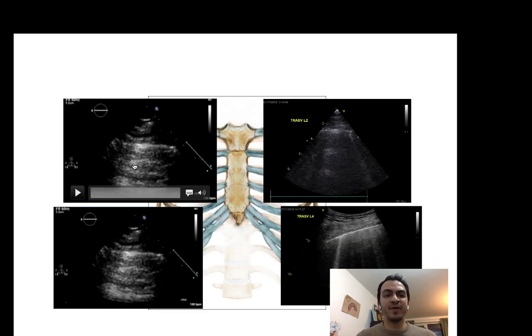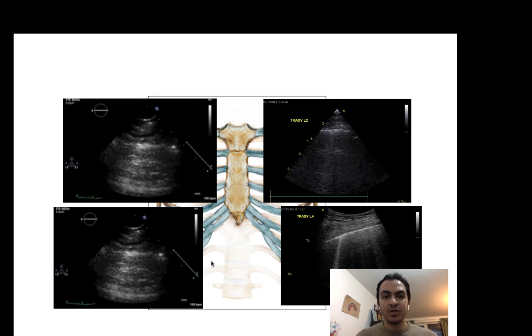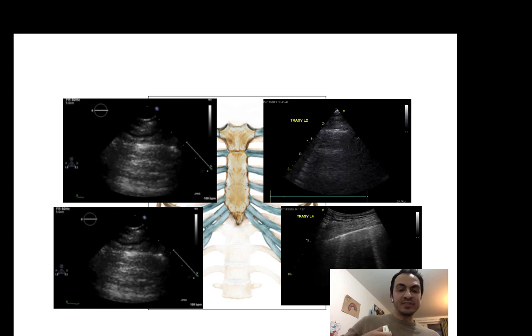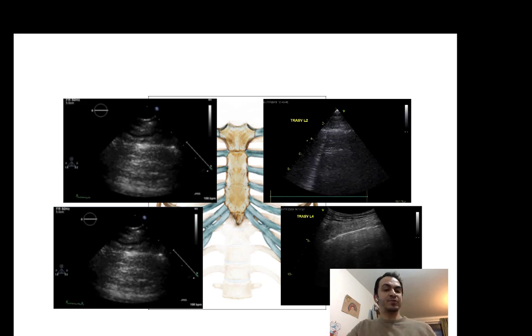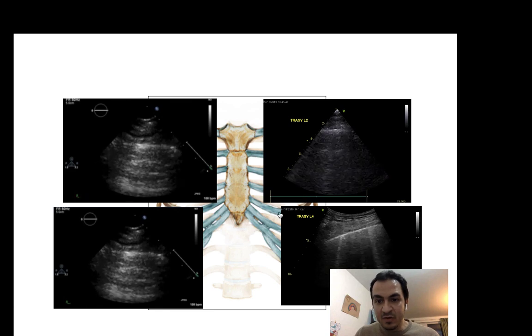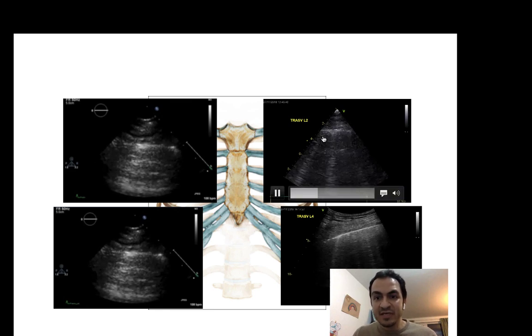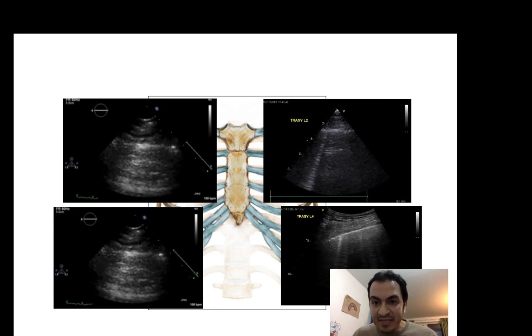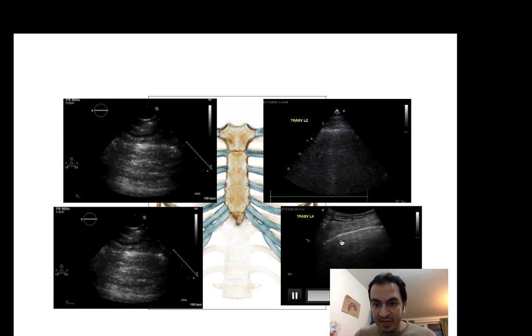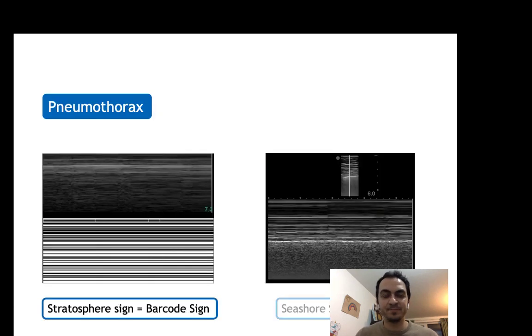And this is an example of a patient who has no sliding on the right side. So we scan the lungs at 2 points anteriorly on the right side, at 2 points posteriorly on the right side. And you can see here absence of sliding on the right side and preserved sliding on the left side. And you could also start to see a different type of artifact from the one that we just saw, which is laser-like beams, vertical-like comet tails extending from the pleural line down to the far field. What are these artifacts? We will discuss this very shortly together.